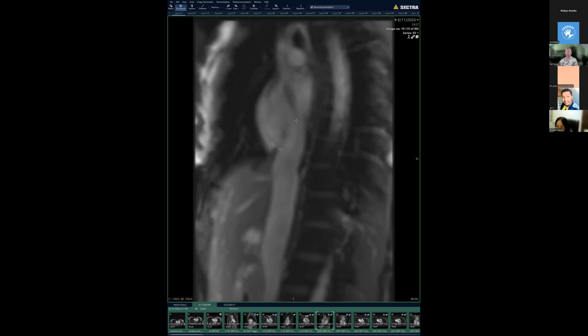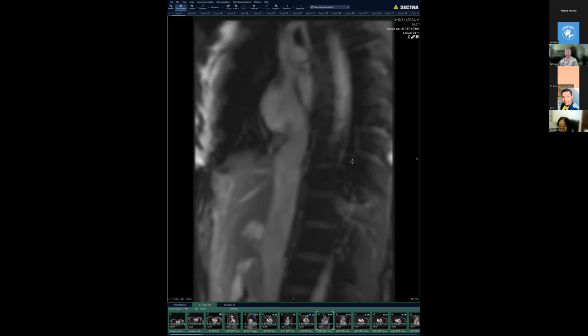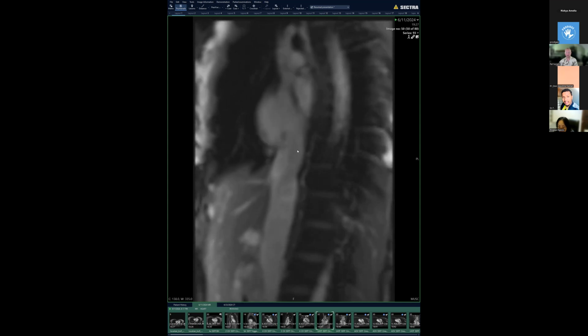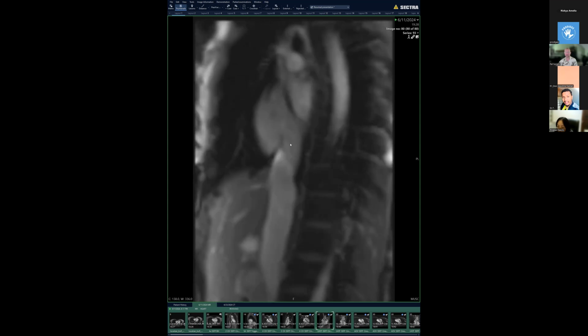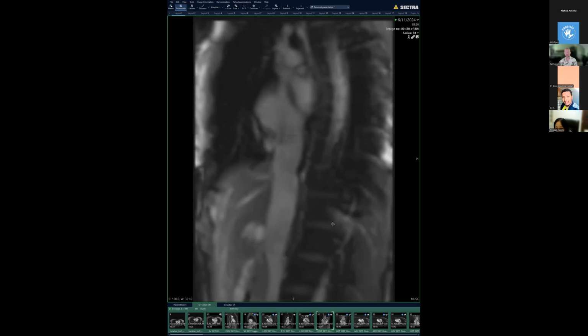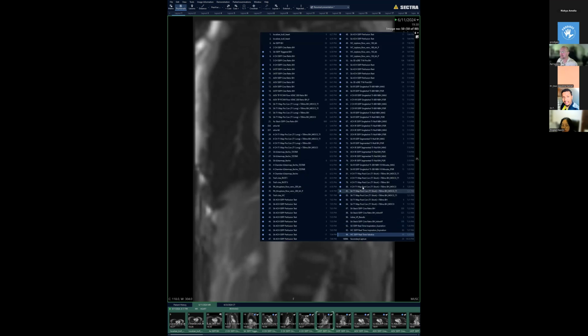And then I thought that maybe we should look at this IVC as well. So we looked at the IVC during the deep inspiration as well with real time. I was really curious if maybe there's some obstruction here. Maybe there's a very prominent eustachian valve, which there is, but it doesn't seem to cause any flow obstruction significantly. It's a little bit narrower here, and this IVC does appear congested, but we were unable to identify the reason for the abnormality other than the pectus excavatum.